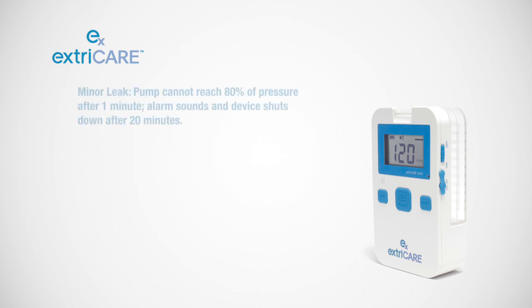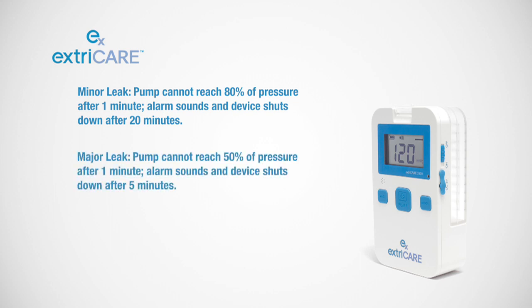For minor leaks, an alarm will sound and the system will shut down after 20 minutes. For major leaks, an alarm will sound and the system will shut down after 5 minutes.